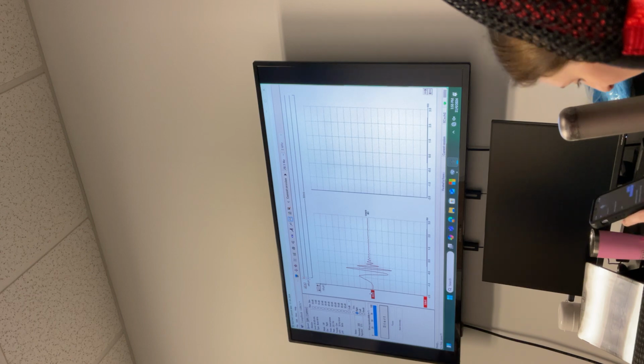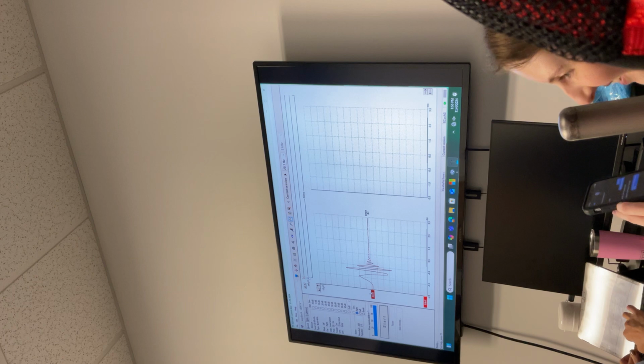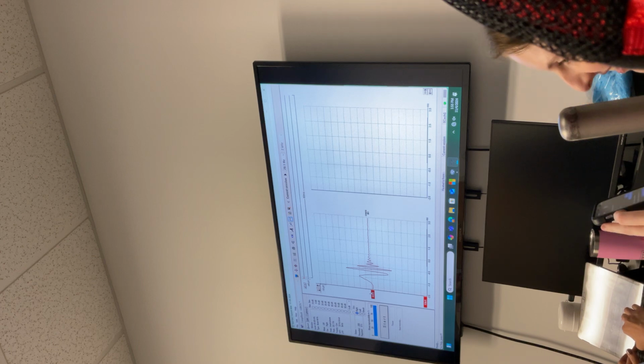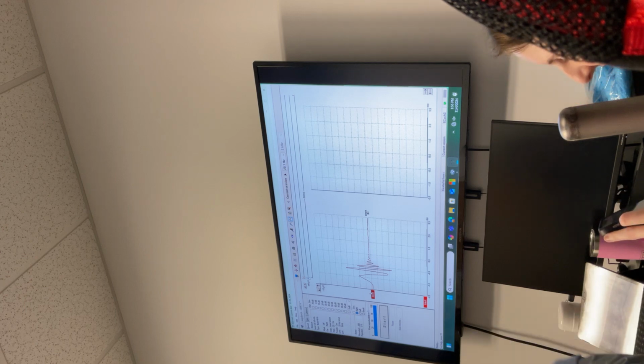Okay. Do you think it's a good or a bad thing? You tell me what is good, what is bad. It's good because if you're familiar with clicks, you're looking for the same. That's the positive thing. The bad thing, does it make the response look earlier than it is?